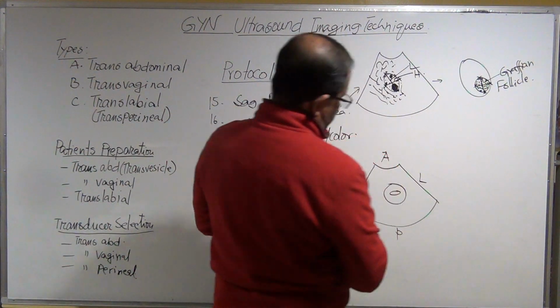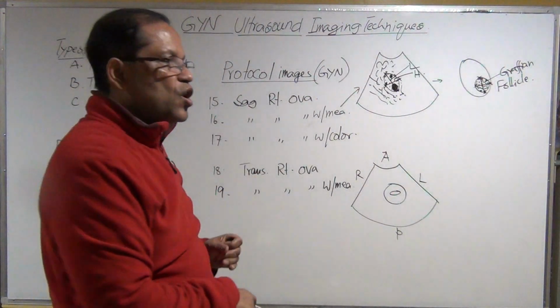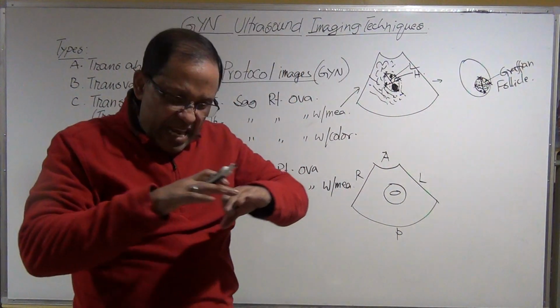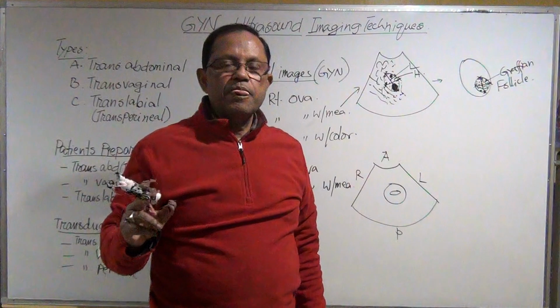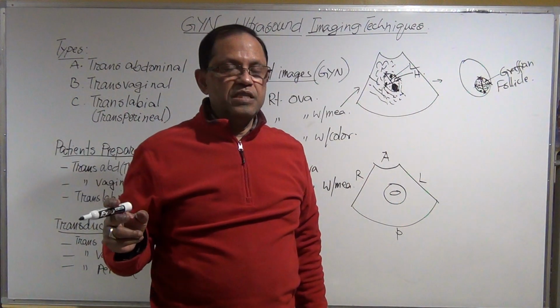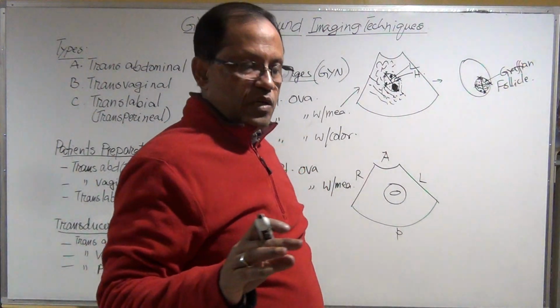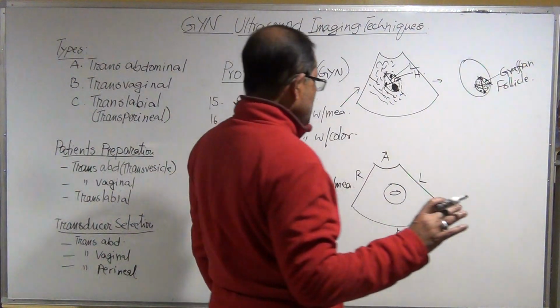It depends on the position of the ovary relative to the uterus. The ovary could be in any place in the pelvic cavity except anterior to the uterus, which is not a normal location.